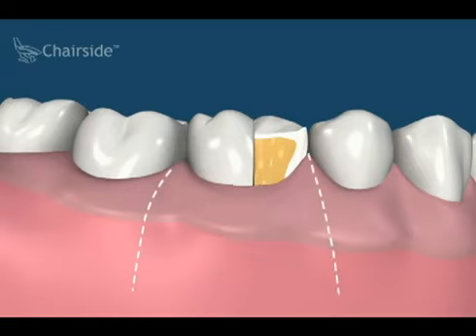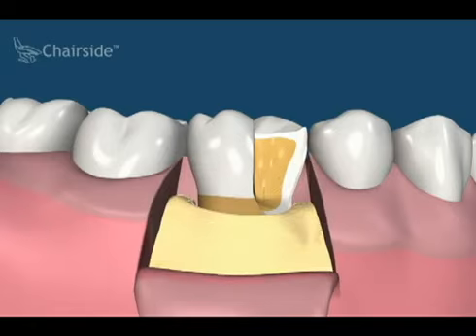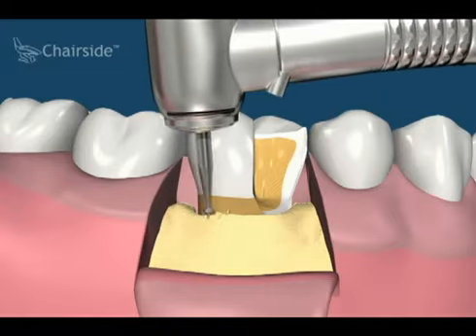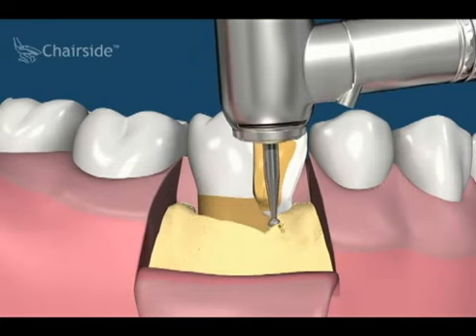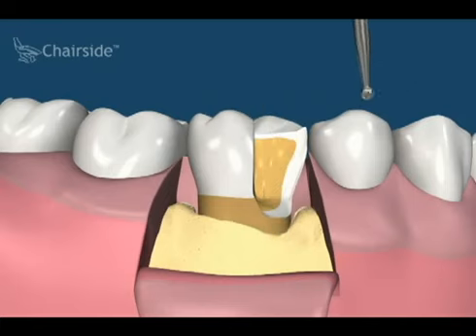First, we raise a gingival flap for access. And then we reduce the bone level so that the bone is a certain minimum distance below the fracture. Different instruments, including the dentist's drill, are used to reduce the bone height, and this new bone architecture is prepared to support the gums in a lower position on the root of the tooth.